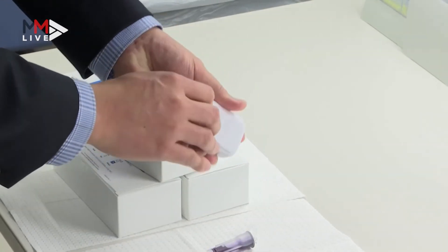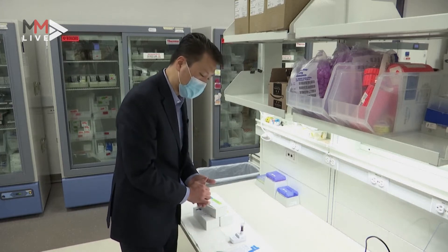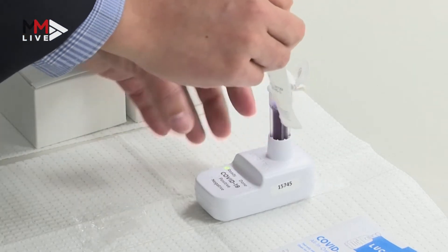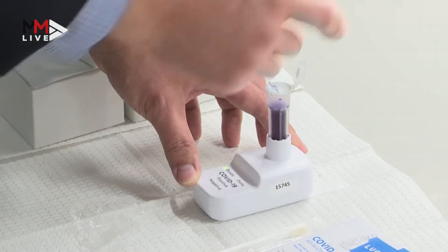Unwrap the nasal swab, swab each nare five times, and then take the swab, dip it into the vial, swirl it around 15 times, then take the swab and discard it.